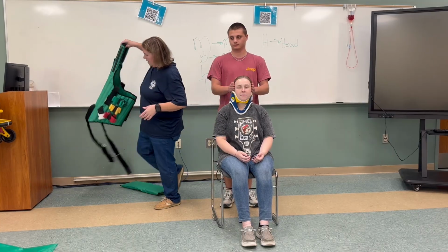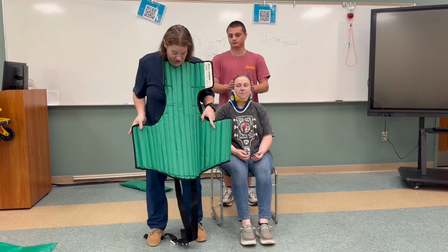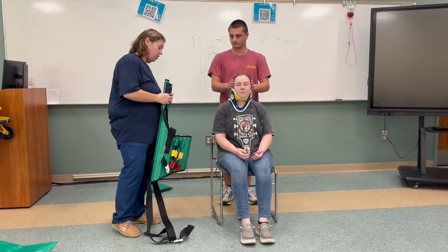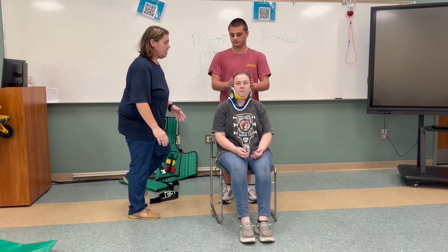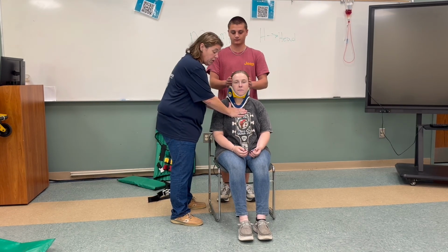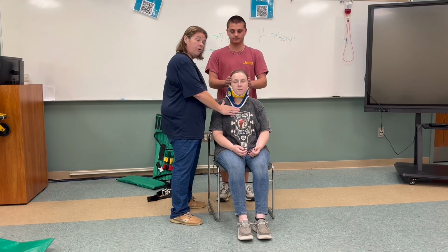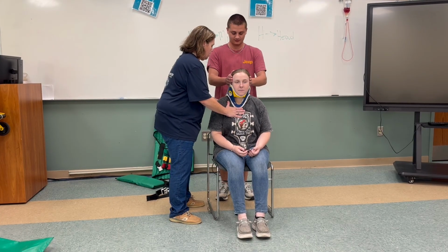my KED, behind the patient. This goes behind the patient just as this, okay? But she is sitting up against the chair. So what we have to do is I'm going to come in and hold her just like this, and my partner, because he is at the head, will count to 3, and we're going to shift her forward at the same time to keep her in line, okay? So on your count of 3, we're going to move her forward just a smidge. 1, 2, 3.